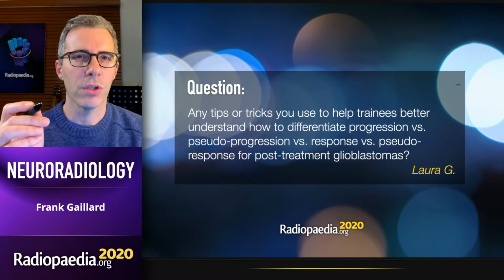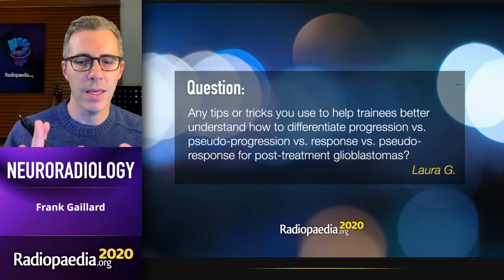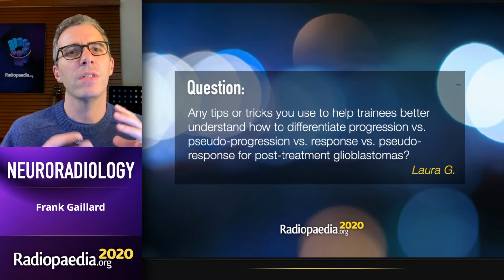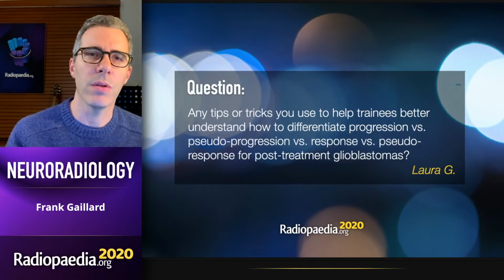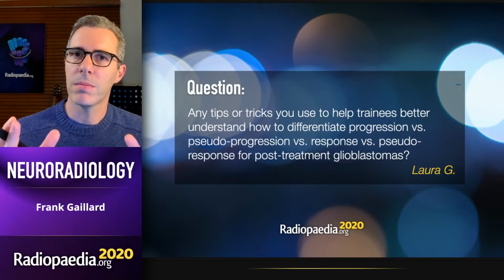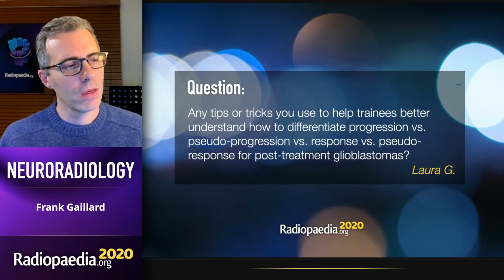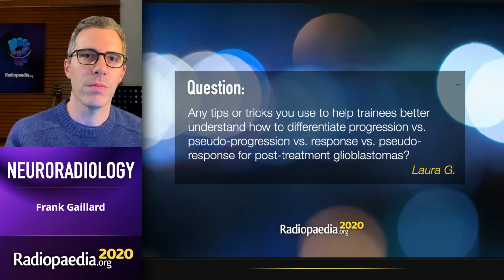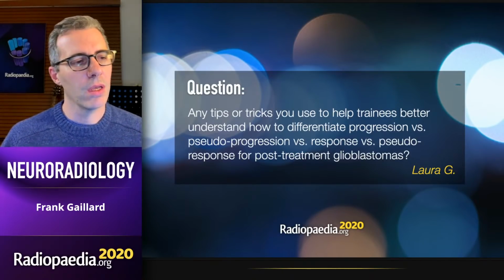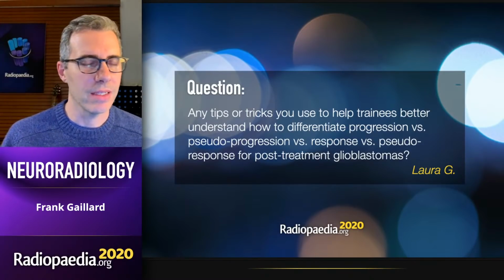I tend to reserve the term pseudoprogression when I can't find any evidence of progression, and therefore I'm saying everything you see here is treatment effect, pseudoprogression, but it looks like progression. And I'll call progression when I think there is definite growing viable tumor, even if there are components of treatment effect. In this case, well, it's a bit hard because there's a large amount of treatment effect up top, lots of vasogenic edema, no elevation of CBV around thin surgical cavity enhancement only. But inferiorly, there's that nodule of tumor that's growing towards the ventricle. So this is mixed. There's progression inferiorly with large component of treatment effect superiorly. And hopefully what would happen here, and what did happen in this patient, is that they get a short-term follow-up scan and a decision is made on change of therapy.